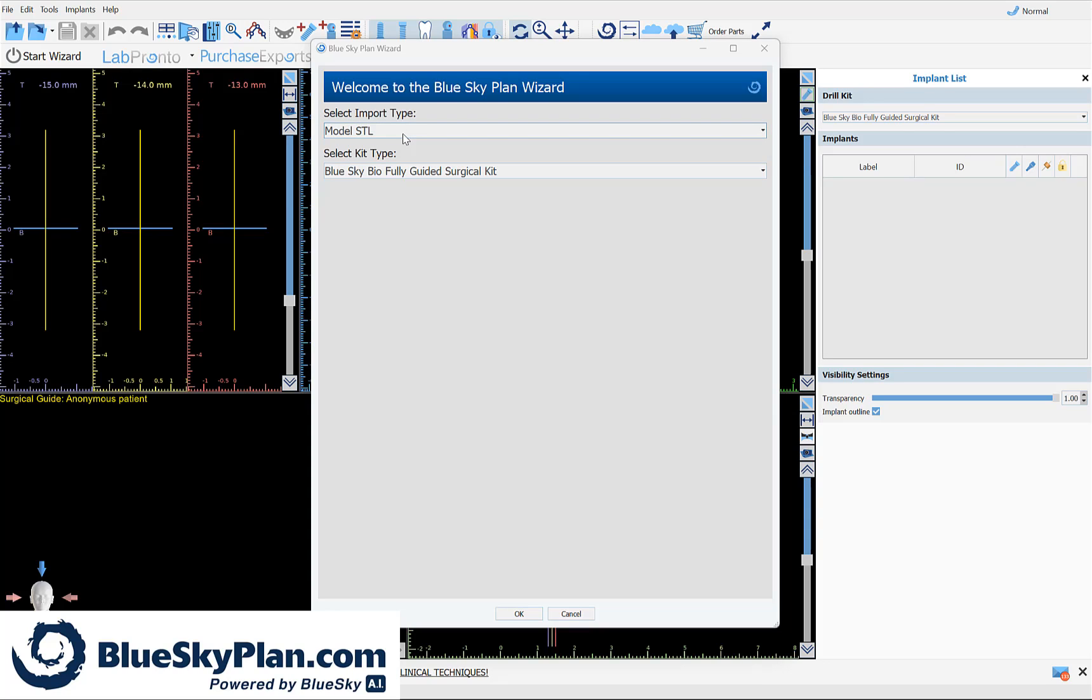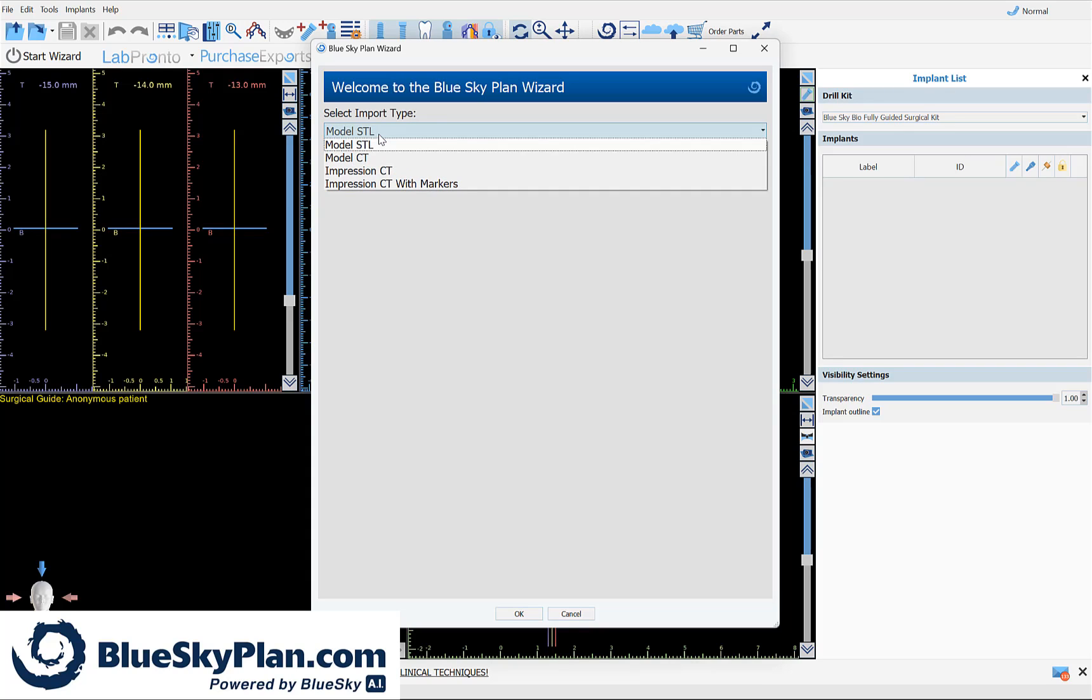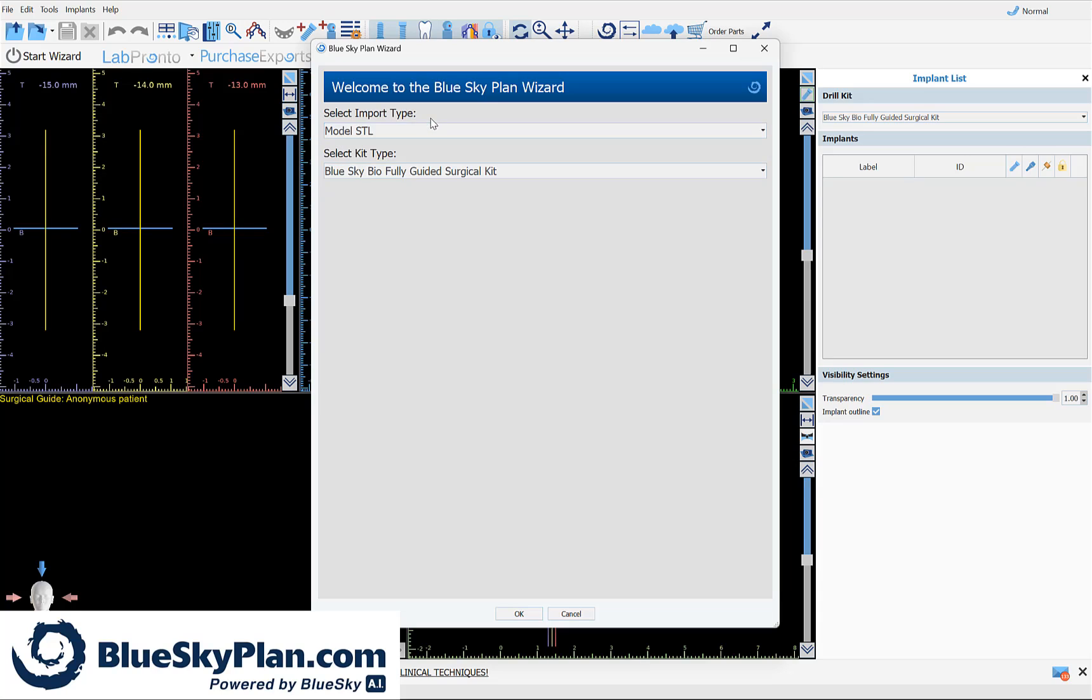Regarding the import type, today it's almost always model STL, but we have additional import process flows for situations where you don't have a model scan available and you can import various CT scans including a model or an impression.